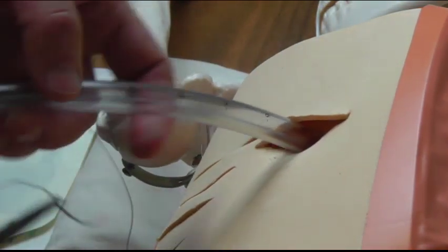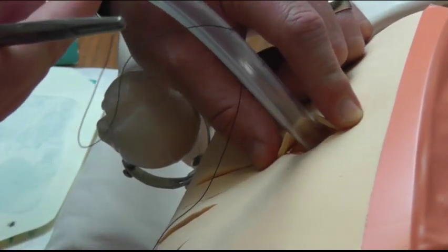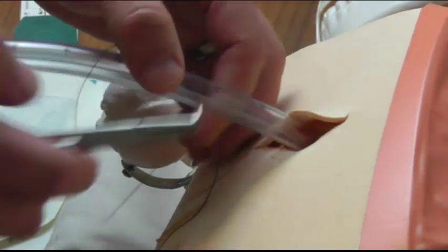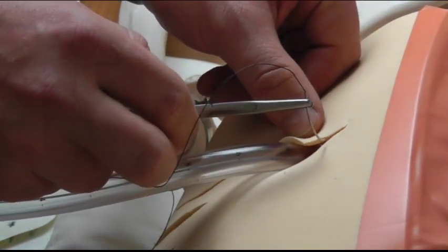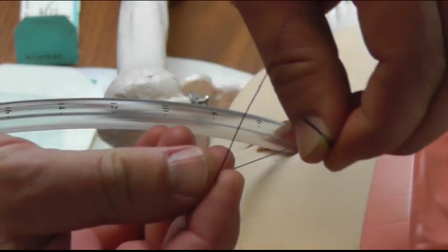So, you start, you've made a decent size hole for your tube there, you've got a three or four centimeter hole, and what you want to do is put a stitch either side of that. So we'll start at the top, and you pull it through until both ends are roughly equal length.